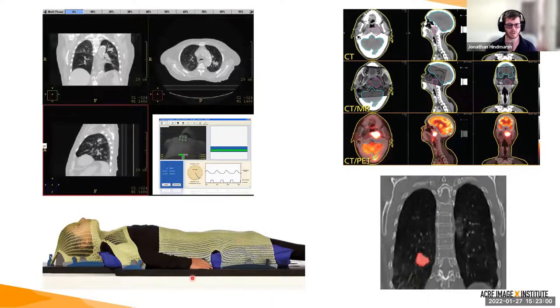You form them over the patient and they harden as they cool down. So they are used to immobilize and restrain the patient to prevent them from moving. This here and here are examples of 4D CTs. So a CT that moves, or that shows time or the breathing cycle. So typically used for lung or abdominal cancers where there is breathing motion involved. And we want to see how the tumor moves while the breathing is going on.